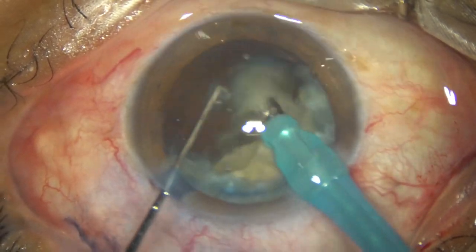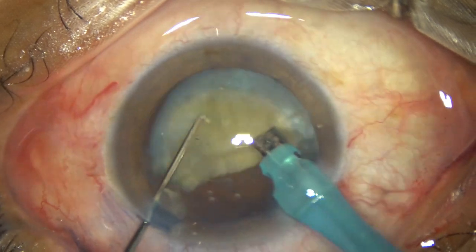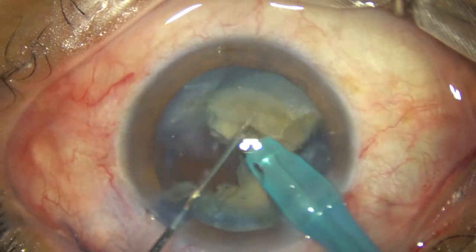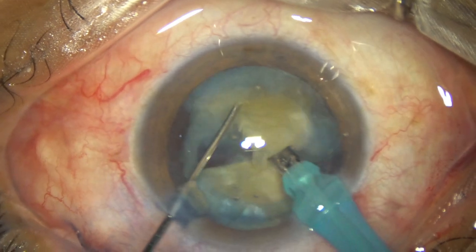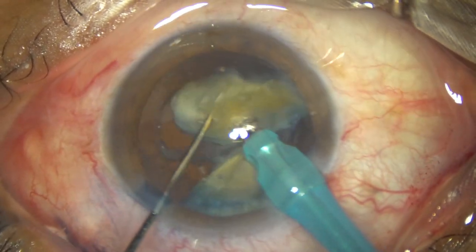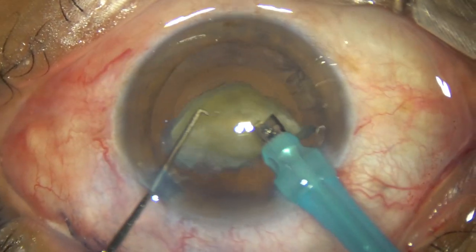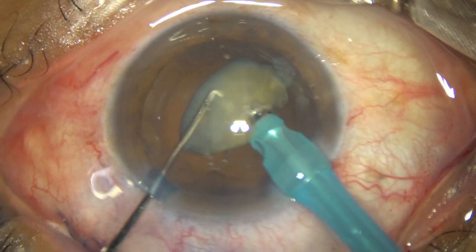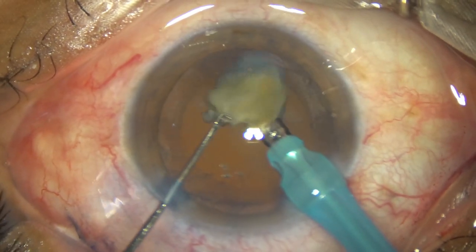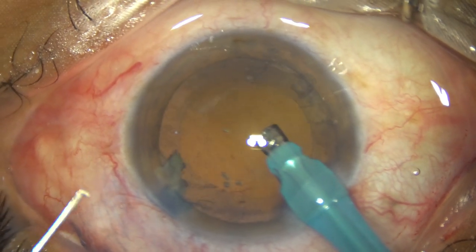One hemi-nucleus has been divided into two pieces and is managed. The other hemi-nucleus is mobilized, rotated, kept in front of the phaco needle, and it is chopped into two pieces. These two pieces are emulsified. Ultrasonic energy used in this case is 70%, flow rate is 40 ml per minute, vacuum is 400 mmHg. This is the last piece. At this time, I decrease the parameters — vacuum 250, flow rate 25 — and the last piece is emulsified safely.